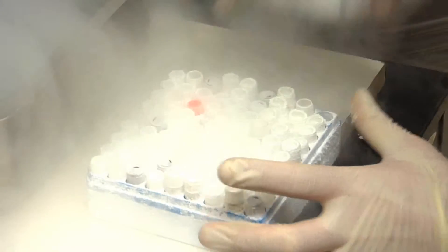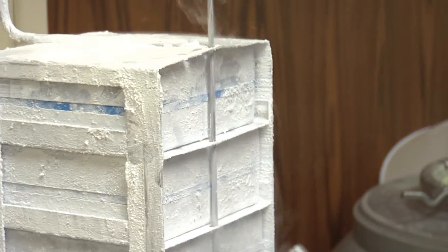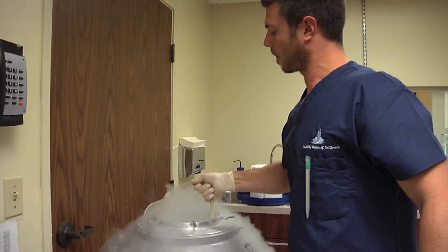We use substances that help to stabilize the specimen for the freezing process. We also take a close look at the quality and quantity of the specimen so that we know what it will be useful for — whether that would be insemination or whether it would require the use of in vitro fertilization.